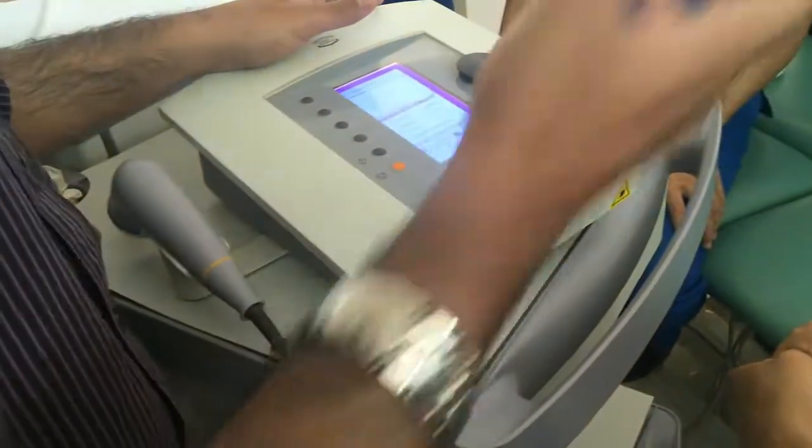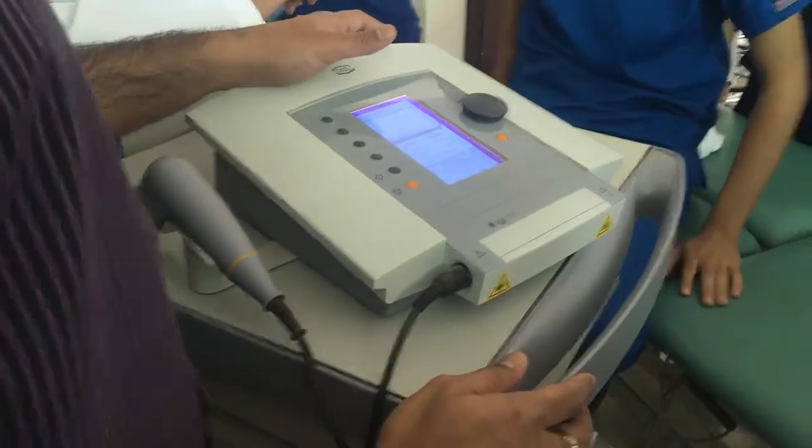You can give 2. That is, open wound is different, 0.5 to 1. Open wound 0.5 to 1 maximum.